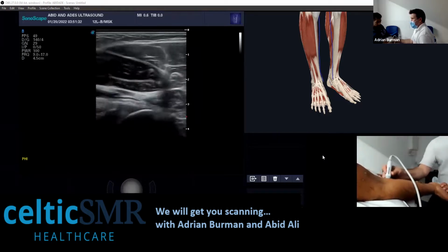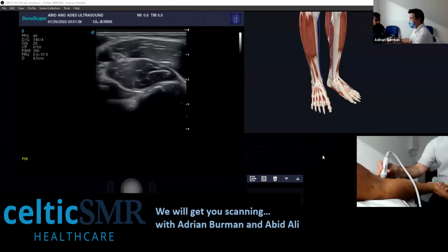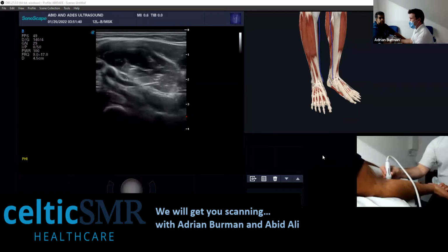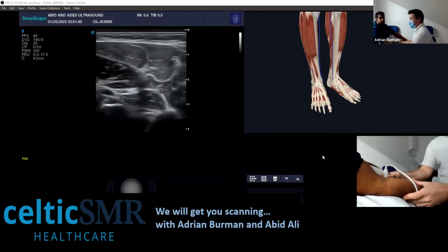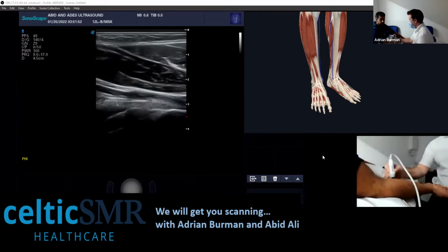So I find that's quite useful with the median nerve. So this is the pronator teres here. It comes down. And when it reaches the bottom underneath the pronator teres, this is the radial tuberosity. And then you just rotate around, angle up, and there you go. There's your biceps tendon.